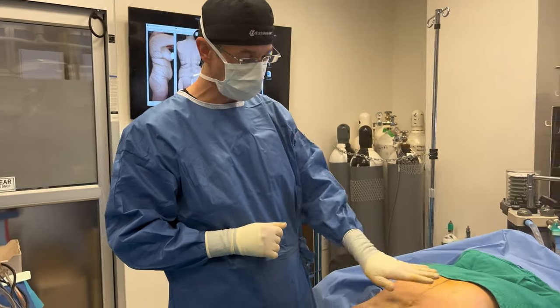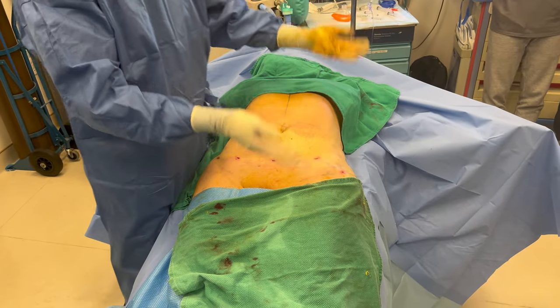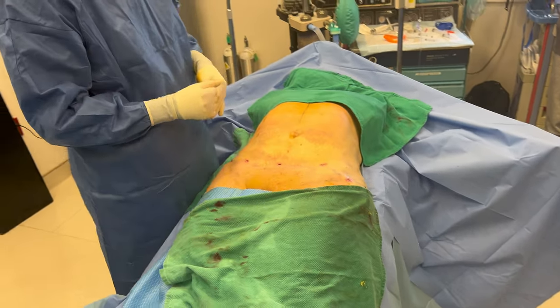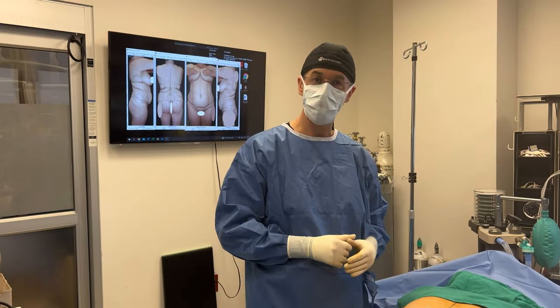We are done with the liposuction. We liposuctioned the lower abdomen, love handles, and flanks all around. We're going to flip her, do some more liposuction on her lower back, more flanks, more love handles, and now starting fat transfer to the butt.